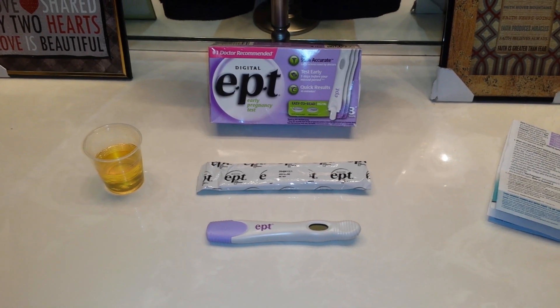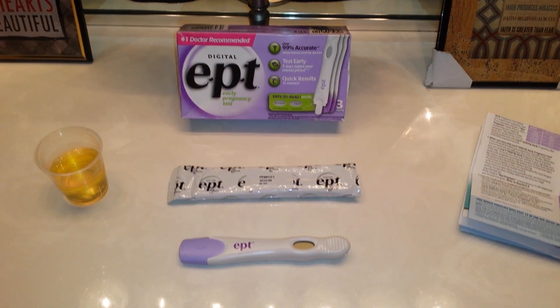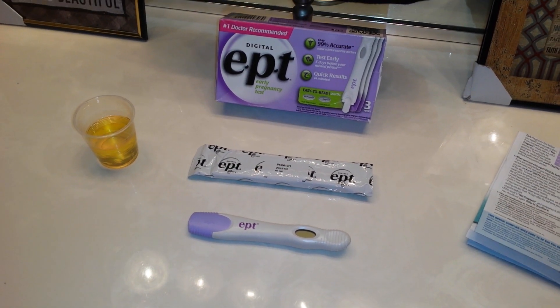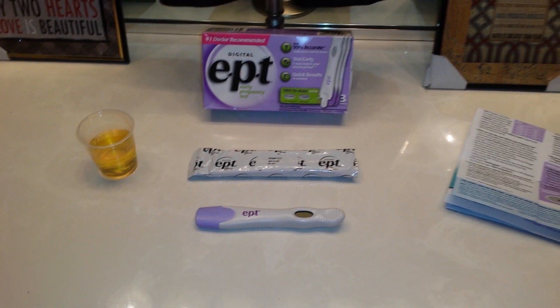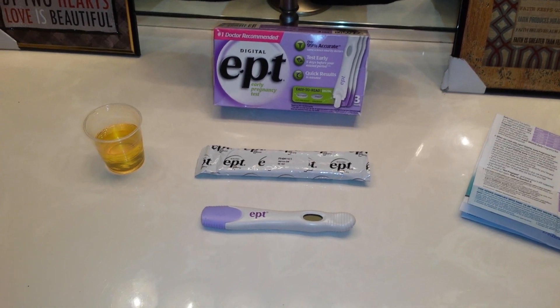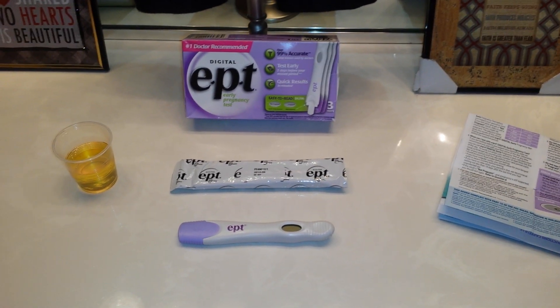Before we get started, I want to specify that with any pregnancy test it's really important to go over the user leaflet and the instructions, because each test can be quite different — especially digital tests. With most directions, you want to start off using first morning urine, FMU, only because it has the highest concentration of the pregnancy hormone HCG. If you opt to use an evening or afternoon sample, you generally want to do at least a three to six hour hold with very minimal liquid intake so it's very concentrated.